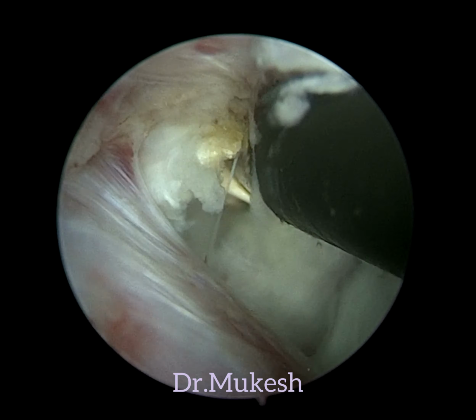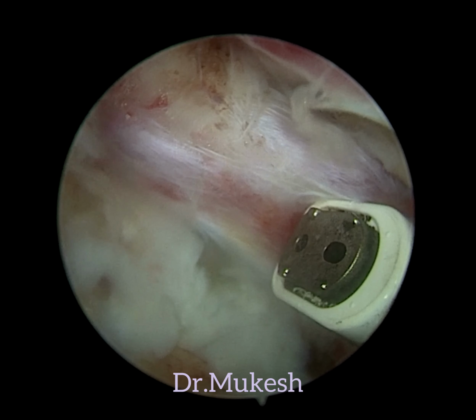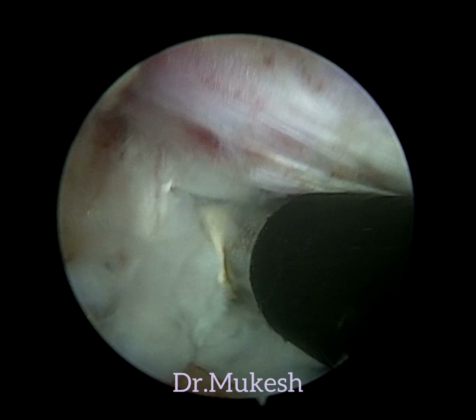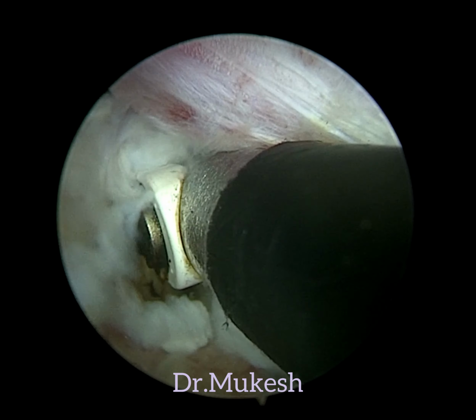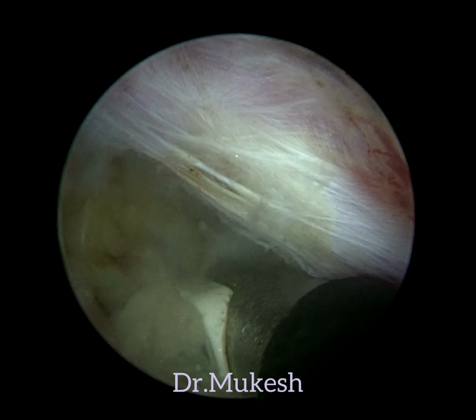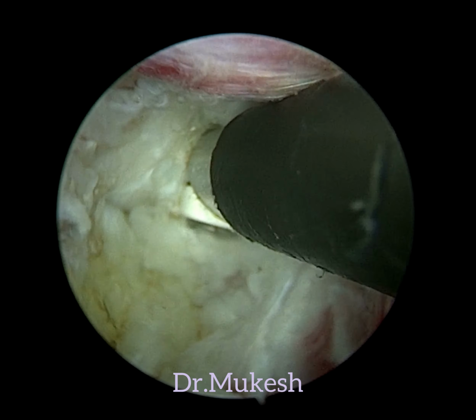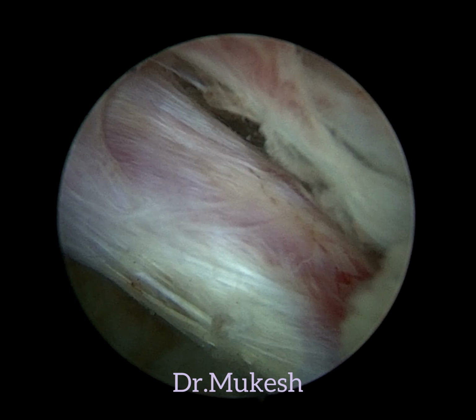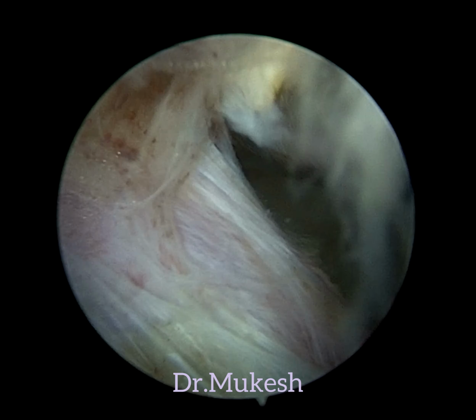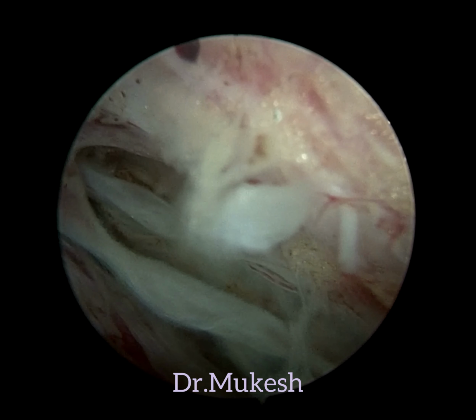So this is axilla. So large fragment was taken out from this axilla, which was medially placed. This is lateral recess, which was bipolarized, cauterized, so that future or recurrent disc herniation can be prevented. So radio frequency is used here in lateral recess and in the axilla also.